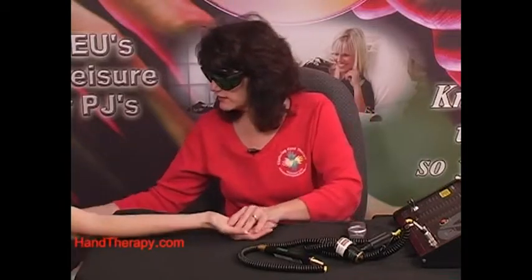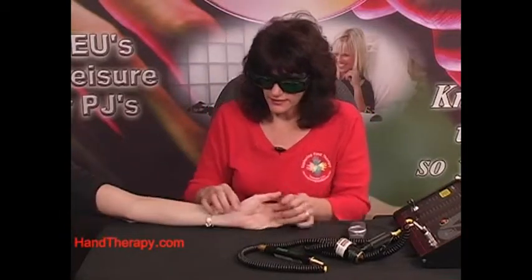Now let's look at post-op pain. Let's say that we have a carpal tunnel incision. And if you want, I can use this arm. So let's say that now she has a carpal tunnel incision, and I want to treat about 1 centimeter intervals close to the margin of the wound, followed by a 20-second sweep across the wound bed.